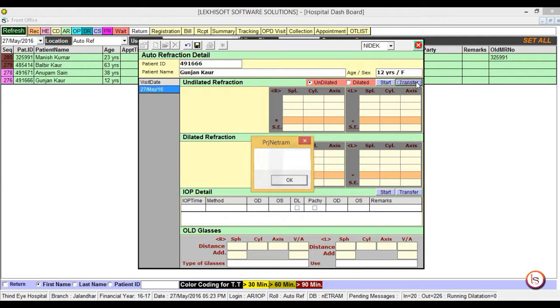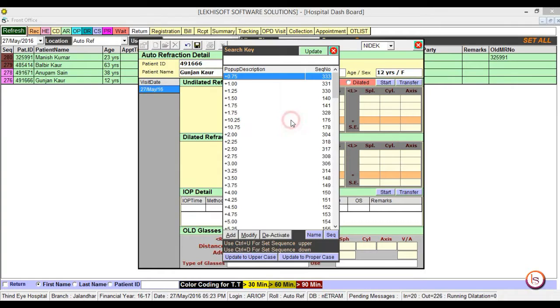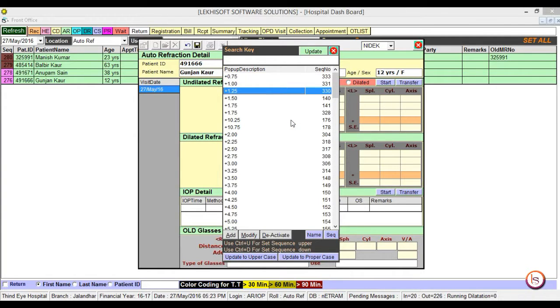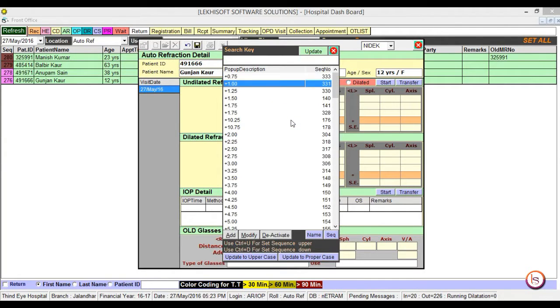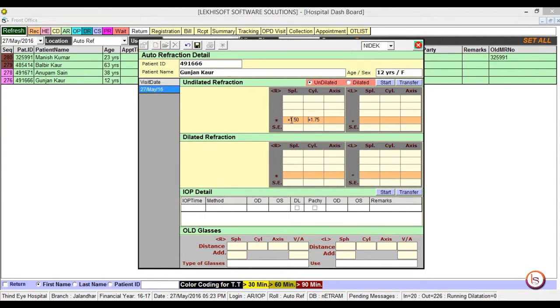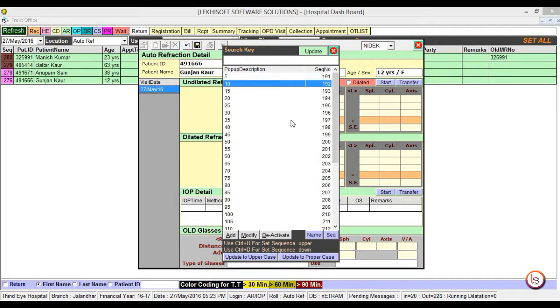In case no machine is connected, you can enter the data here easily using help sections provided. Select the data and press tab. Select the data and press tab. Select the data, then press enter key.